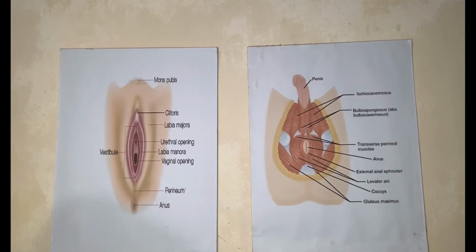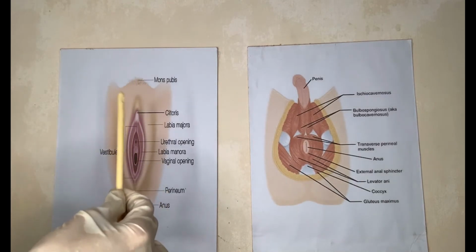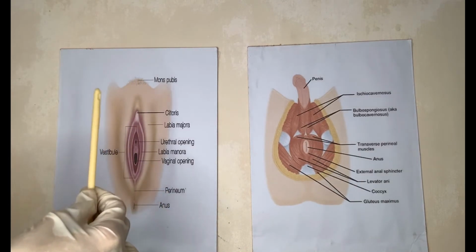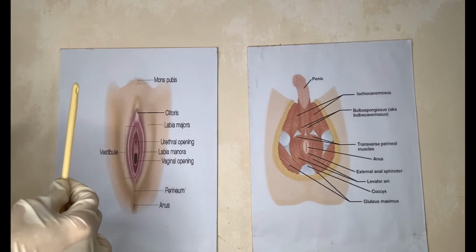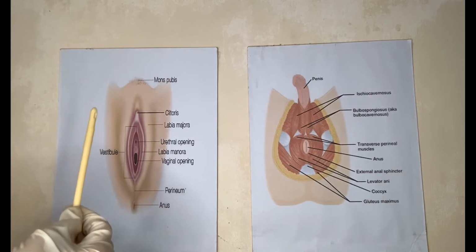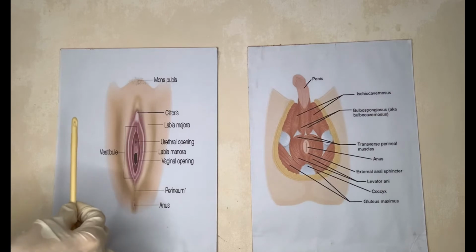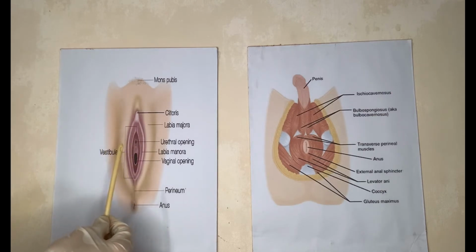So now we proceed to inserting the catheter. Grasp the catheter firmly 5 to 7.5 centimeters, which is 2 to 3 inches from the tip, and ask the client to take a slow deep breath and insert the catheter as the client exhales. Slight resistance is expected as the catheter passes through the sphincter.